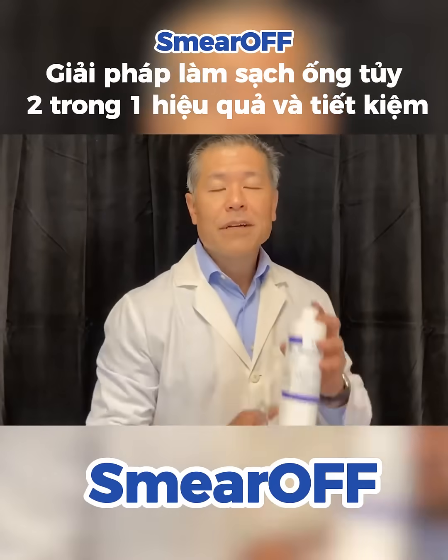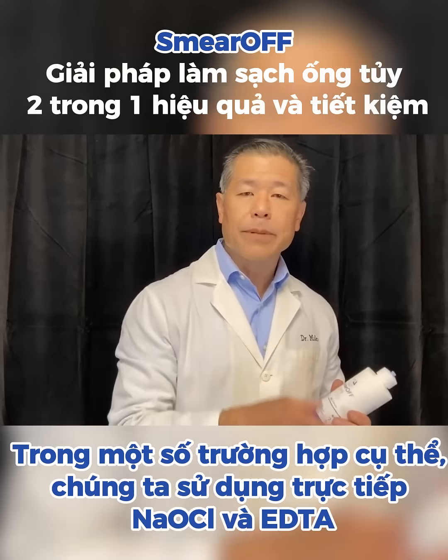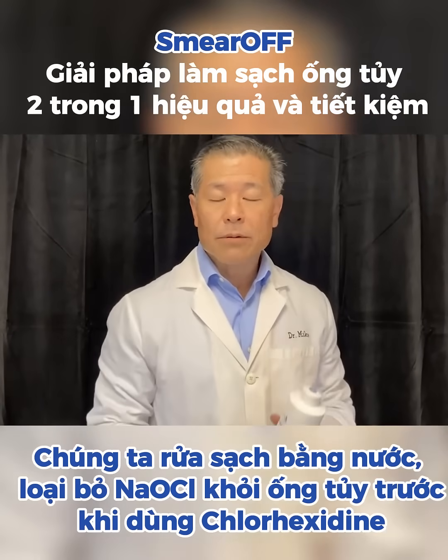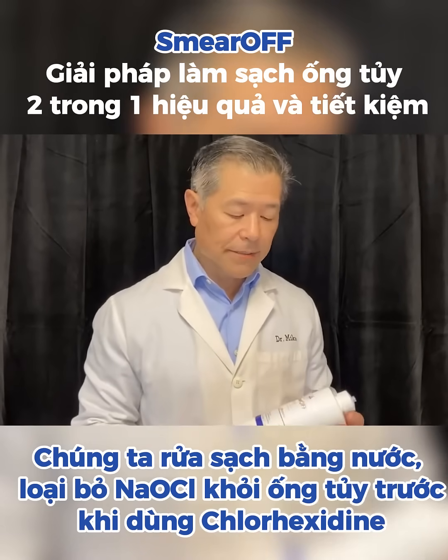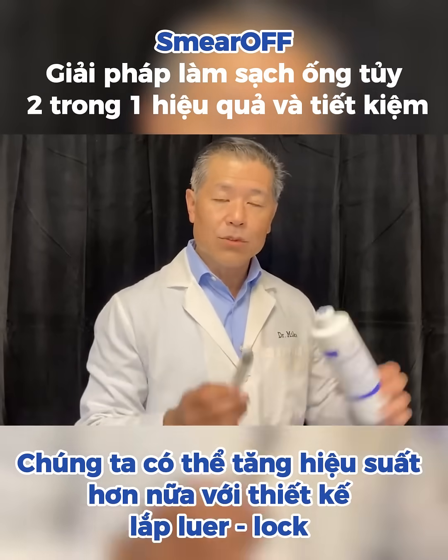In a typical situation, what we do is use a straight sodium hypochlorite, then use the EDTA, rinse with water — we have to remove the sodium hypochlorite from the canal before we apply the chlorhexidine. Well, what we're able to do now to increase the efficiency again is we've got the luer lock attachment.